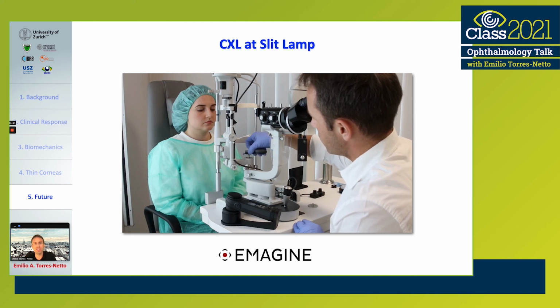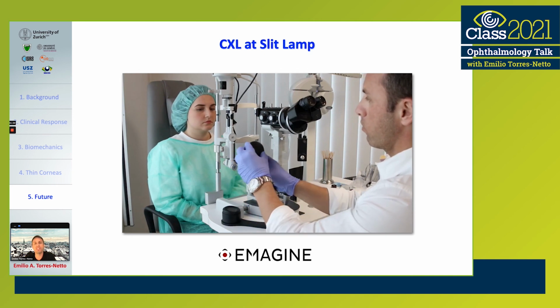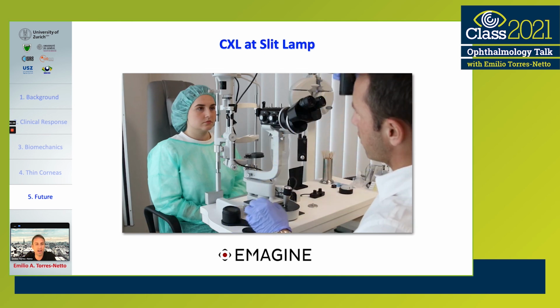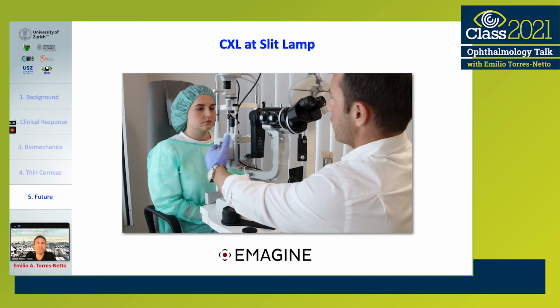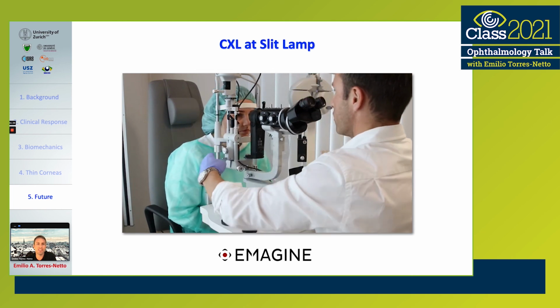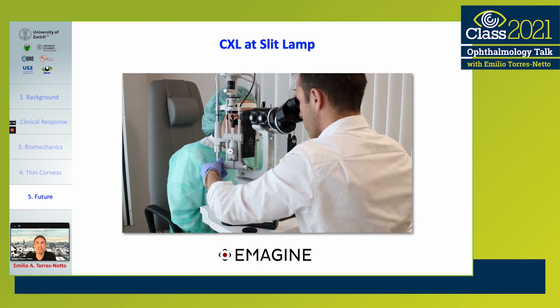So using the cross-linking at the slit lamp, from now on, we would allow patients to be treated even in very remote areas where an operating room is not available. And here you see a video showing how this device would fit in a standard office. So you see it's very easy, and the treatment can be done in the office.